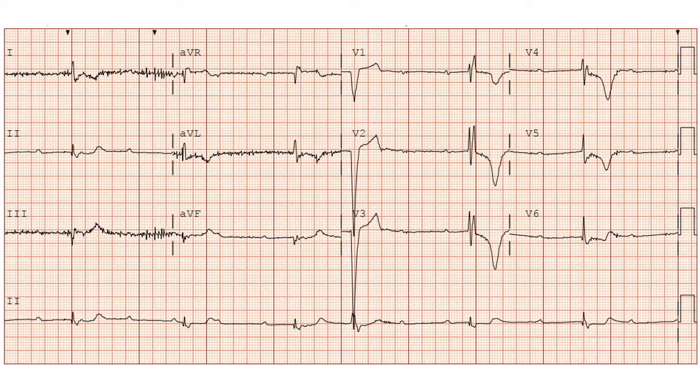I'm not talking about this case. In this case, it's a very, very low dose. But even if somebody has 100 milligrams BID of metoprolol and comes with complete heart block, and the sinus rate is what it is here, it is unlikely to be the beta blocker, because if the beta blocker is causing it, it will first cause extreme sinus bradycardia.